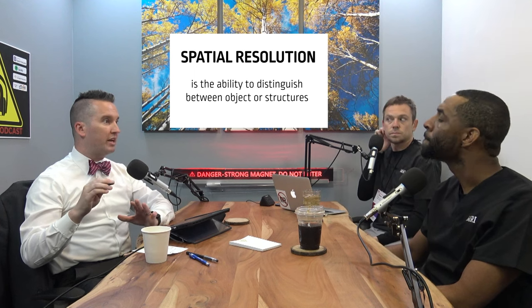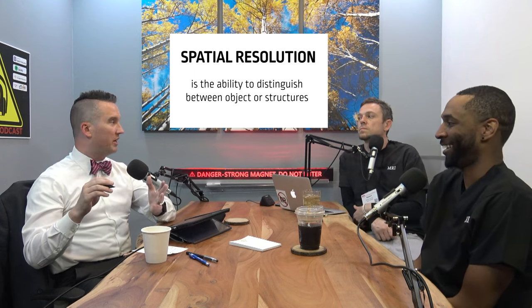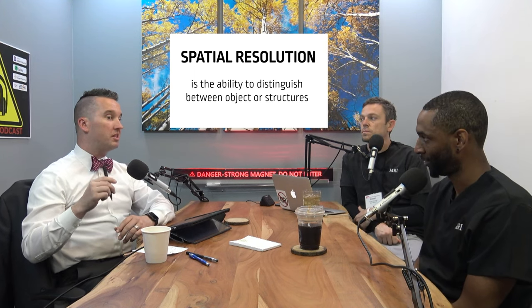We're fighting for 256 by 224, you know what I mean? But you do not pay a time penalty. So CT, because of its ultra high resolution, can visualize the walls in much greater detail. But obviously there are drawbacks to CT contrast.